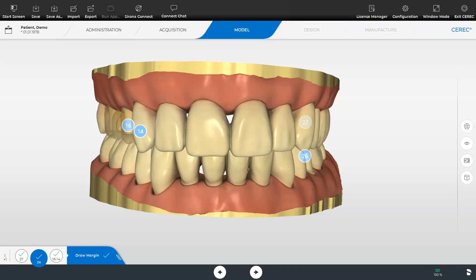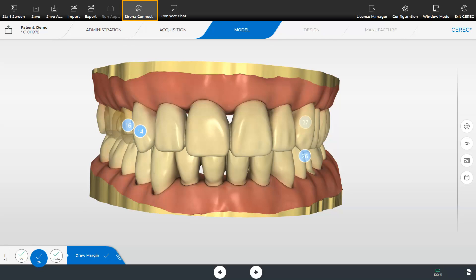In case you do not want to design or fabricate certain restorations chair side there are two ways in which the data can be transmitted via the connect case center portal or by exporting to a storage medium. For the first option click the Sirona Connect option and send the file data to your practice lab or your preferred dental lab.